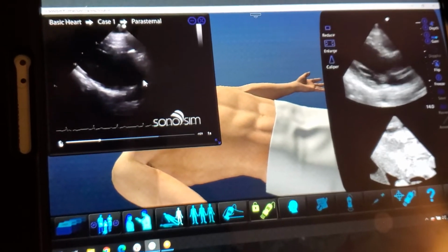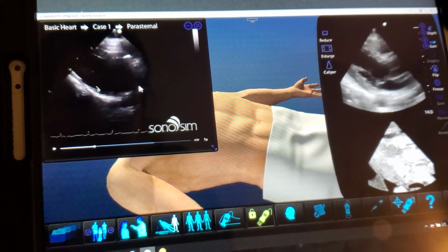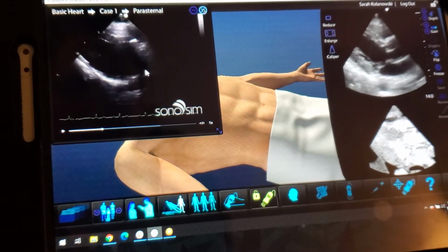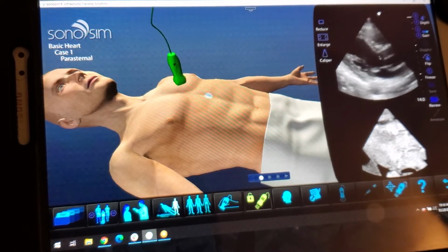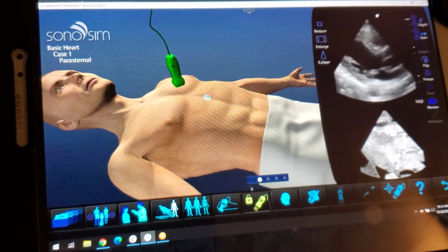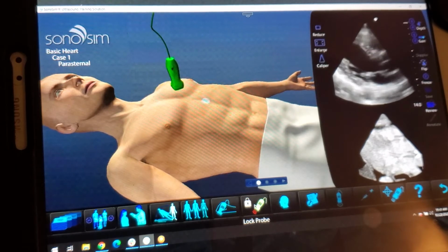So as you can see, a real ultrasound, this is taken in a clinical setting with a real ultrasound machine. They'll walk you through everything. Like I said, there's a few more degrees of movement. They're able to scan around that anatomy a little bit more, but it is the same images that you're seeing up here. They will walk you through the long and short axis views as well. There is a different findings video for each scanning window. So we've been in the parasternal window this whole time, long and short axis.